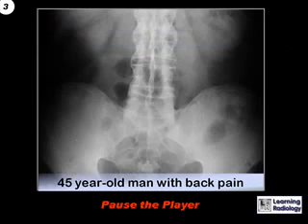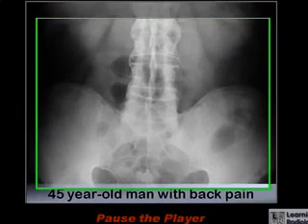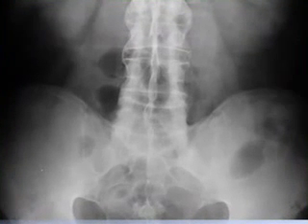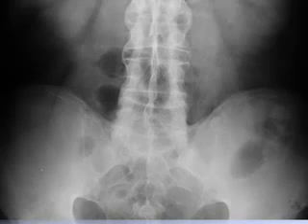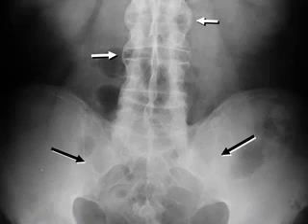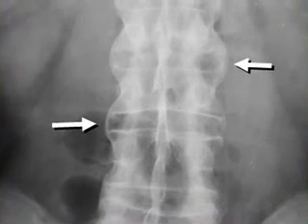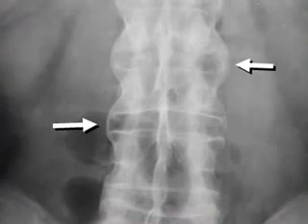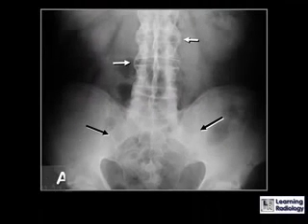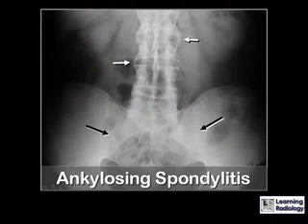The next case is a 45-year-old man with back pain. In this case, the sacroiliac joints are both fused, and there are thin syndesmophytes that join each of the vertebral bodies in the lumbar spine. This is ankylosing spondylitis.